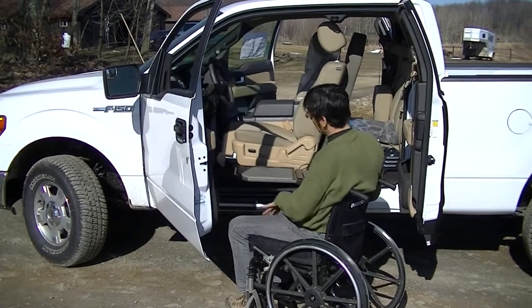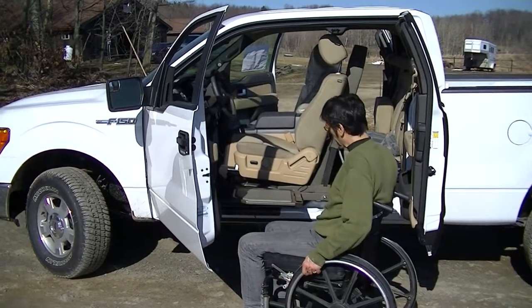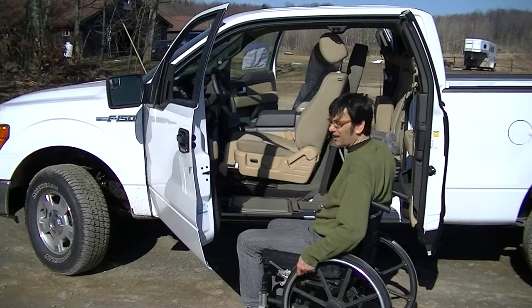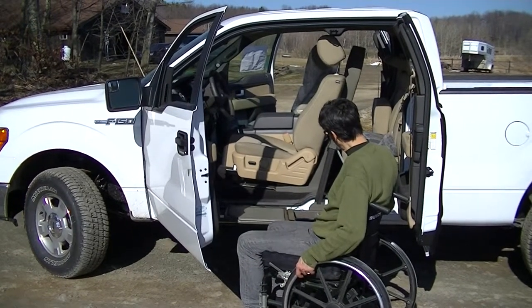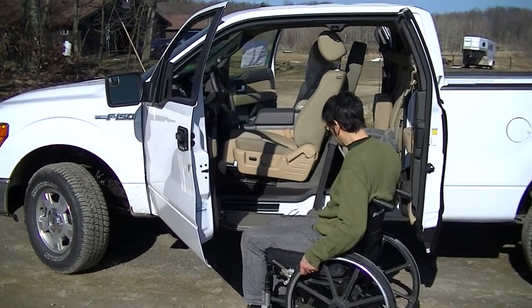Once the seat gets down to a level transfer situation, we transfer onto the seat. We'll be able to adjust the height in order to get the wheelchair in properly. You can see we're well below the rocker panel and we can stop almost anywhere.